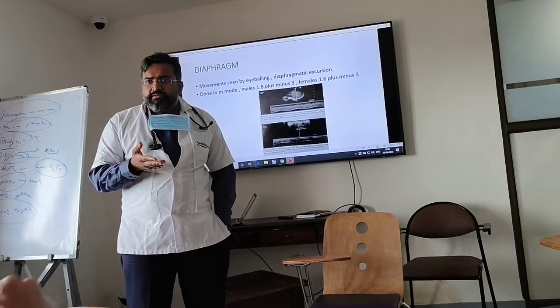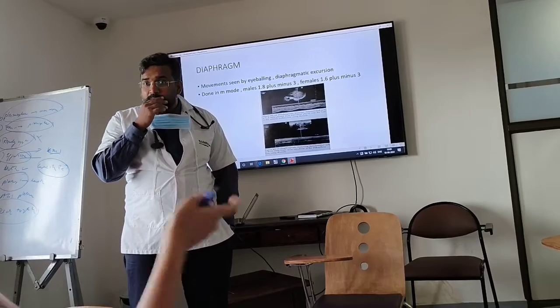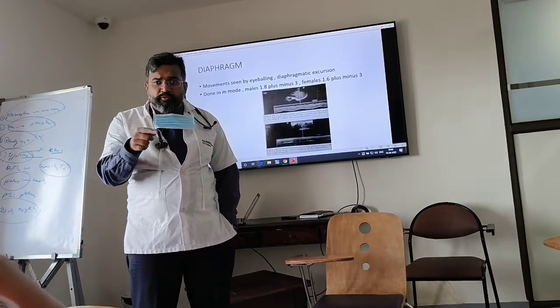Sir, I have the video of the M mode of that patient on my phone. Of that patient. It's on your phone. You put it on this one.